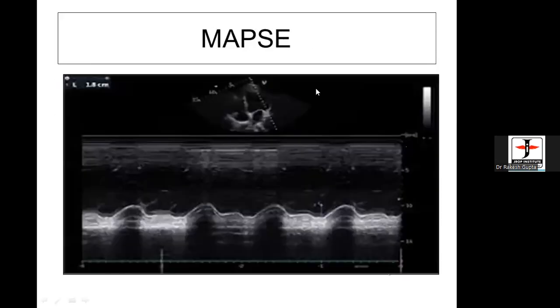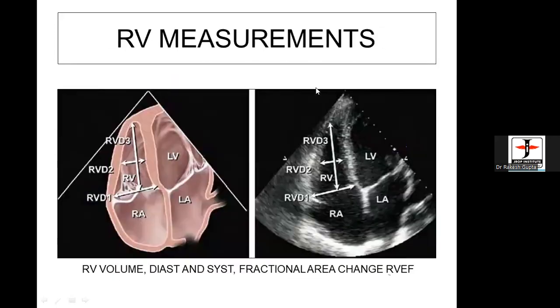In the common literature, the ejection fraction of the right ventricle is a more cumbersome process for echocardiography, and 3D ejection fraction of RV correlates very well with MRI ejection fraction. So whatever people are writing, just ask them which method they are utilizing. The correct method is 3 dimensions echo. They cannot use TAPSE for this. TAPSE will give you systolic contraction. Report TAPSE as TAPSE.